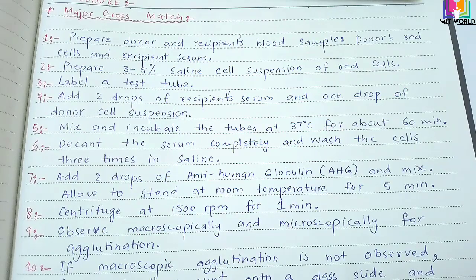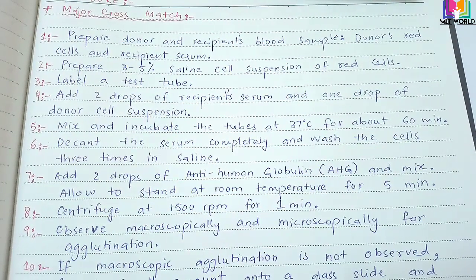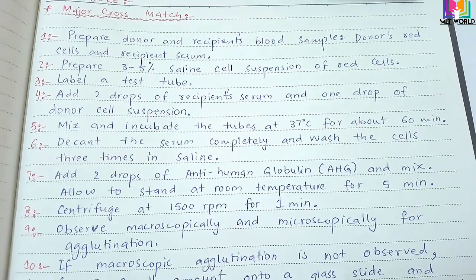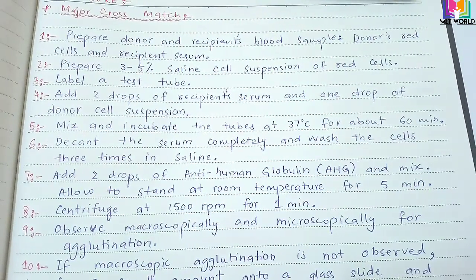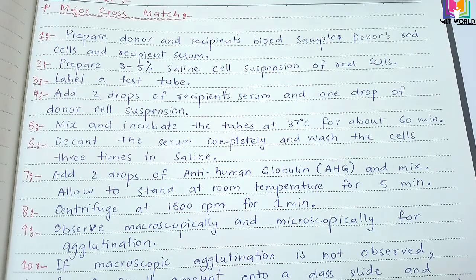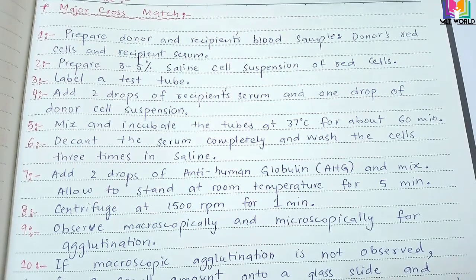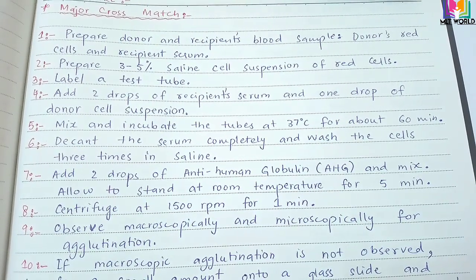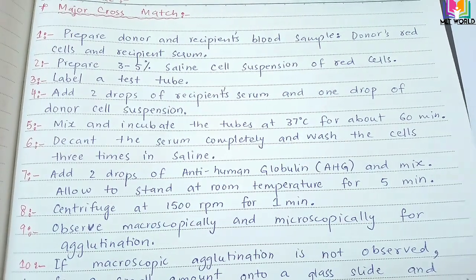So how will we check in the microscope? You can take one drop from the tube, keep it on a slide and observe under the microscope. If you see visible agglutination, that means the donor and recipient blood is incompatible. But if you do not see any visible agglutination, that means donor and recipient blood is compatible.